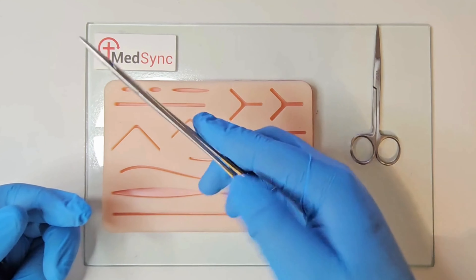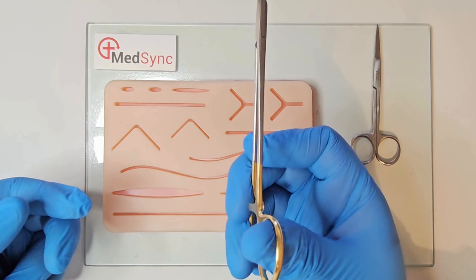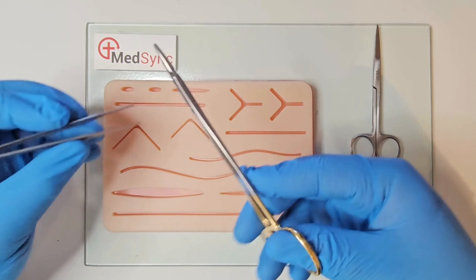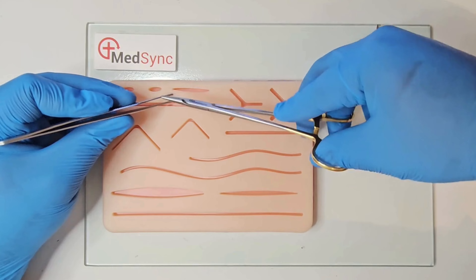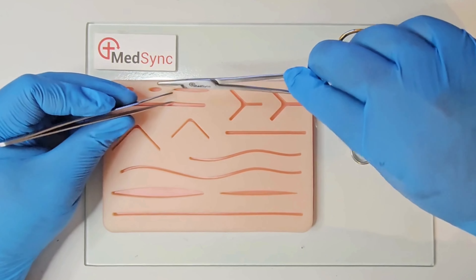You apply opposing pressure on the rings to open and lock the ratchet. The forceps are held in the other hand and can be used to grasp or reflect the skin back in order to see its layers. The needle holder rotates in your hand, going from prone to supine, driving the needle through the skin.